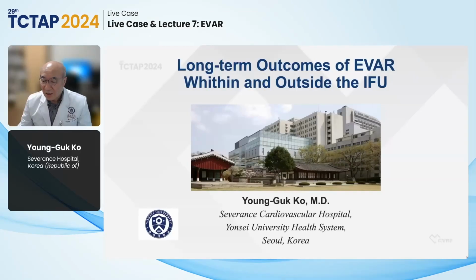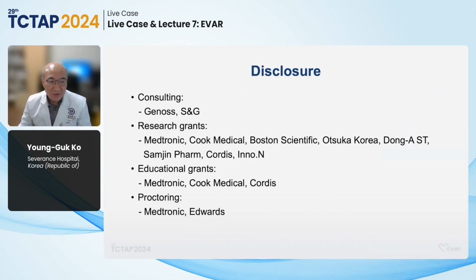Good morning. I'm Young-Guk Ko, working at Severance Hospital, Seoul, Korea. It's my great pleasure and honor to present our EVAR experience. The title of my talk is Long-Term Outcomes of EVAR Within and Outside the IFU. These are my disclosures.